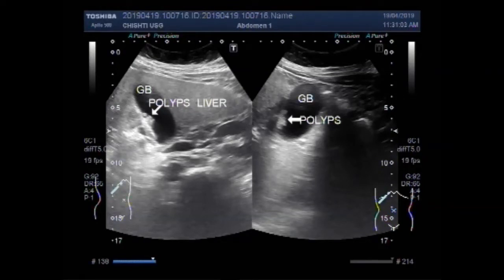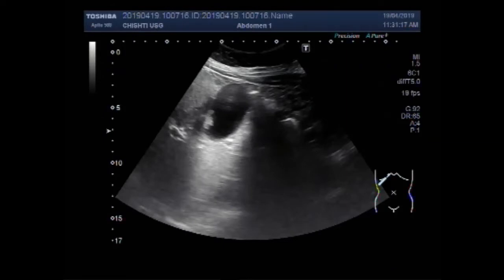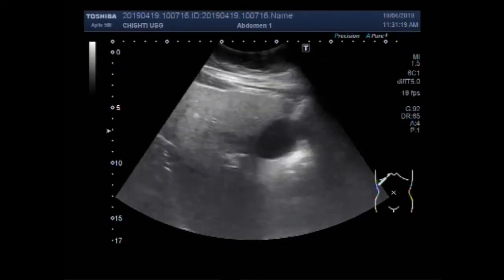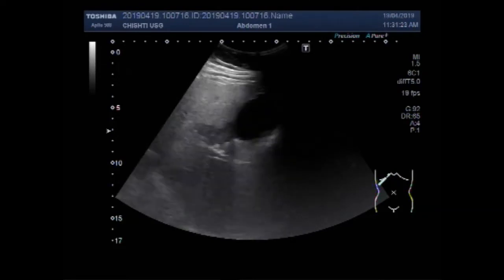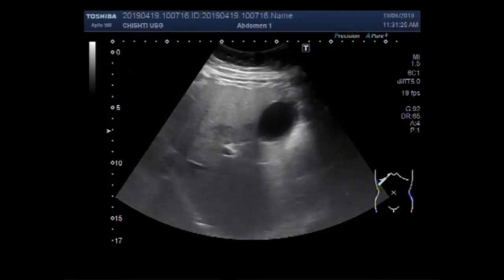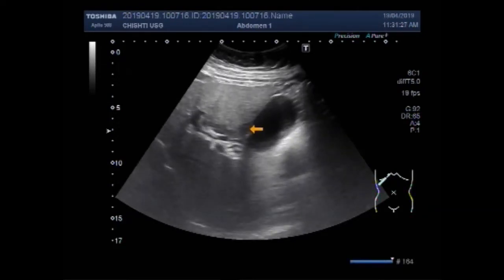This ultrasound video shows a bunch of multiple small polyps along the interior wall of the gallbladder. You can see the gallbladder here, and this is the liver.